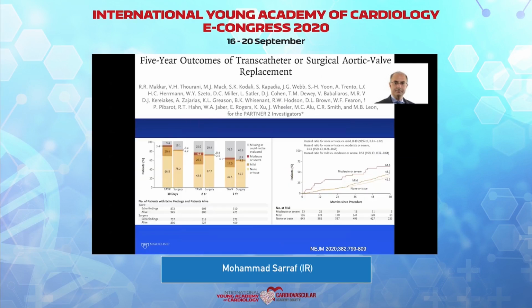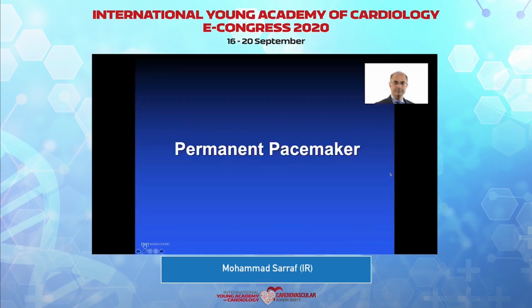mechanism of this switch is, but one of the mechanisms that has also been referred to in the paper is possibly the PVL, in which roughly about 3% of the patients have moderate or severe PVL. Clearly, these patients continue to have really bad outcomes, even early on. Within the first few months, you can see that the Kaplan-Meier curves continue to diverge and then continue up to 5 years. And actually here, the number at risk is barely anything. So many of the patients who had moderate or severe PVL have died. And even mild PVL seems to have a trend, although it's not statistically significant.